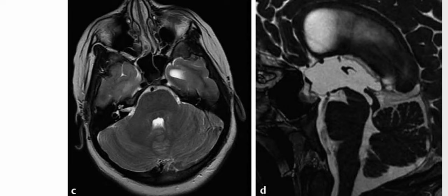The high resolution sagittal T2 FIESTA image is showing that there is focal narrowing of the inferior cerebral aqueduct with a small web. There is a small web here, and there is focal narrowing of the inferior cerebral aqueduct, and the proximal aqueduct is dilated. So considering this key finding of the narrowing of the cerebral aqueduct with the lateral and third ventriculomegaly, the diagnosis here is aqueductal stenosis. So this is a case of aqueductal stenosis.